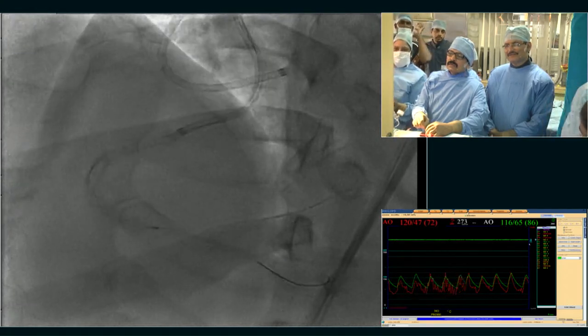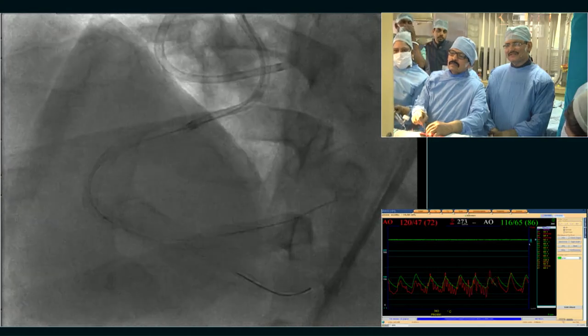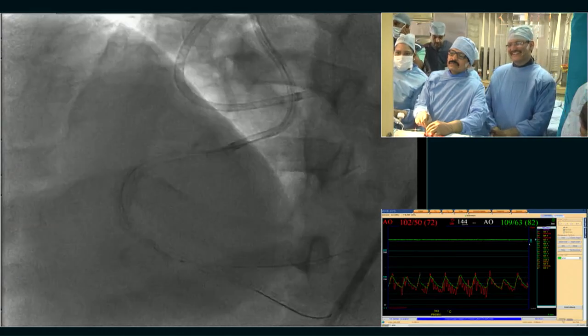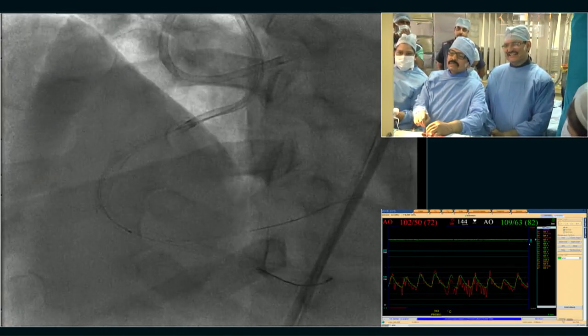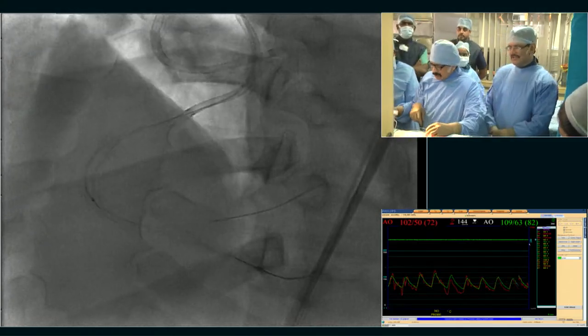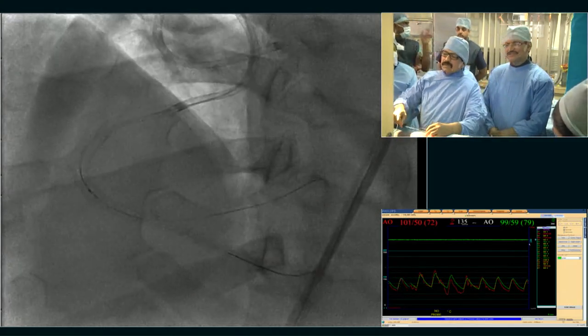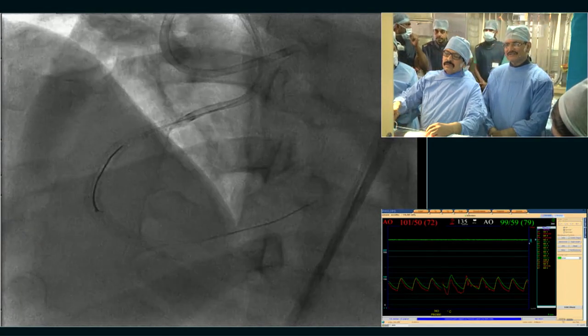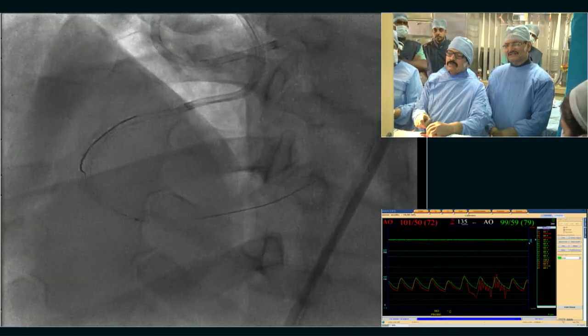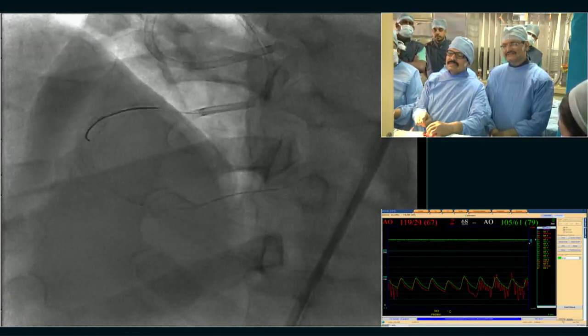It went in, didn't it? Yes, we had difficulty. No, not that one first. First the white wire, you have to take this white wire here. Slightly. Okay, you can go ahead now. You try. As you said, it is tough.